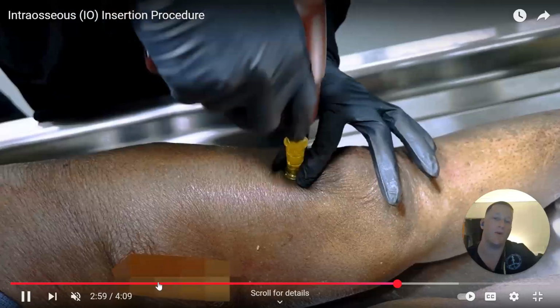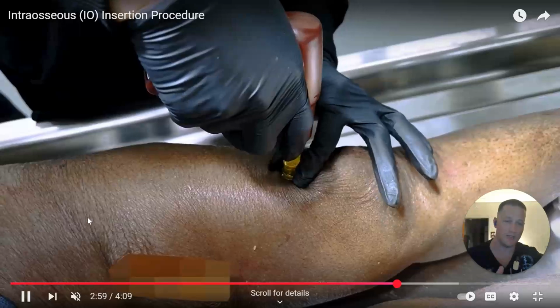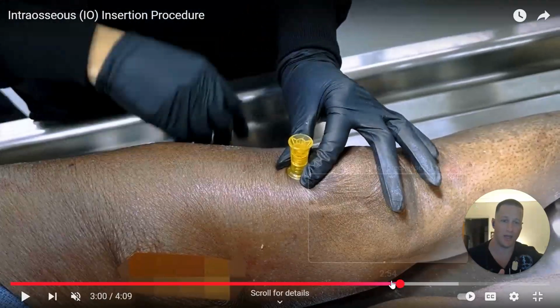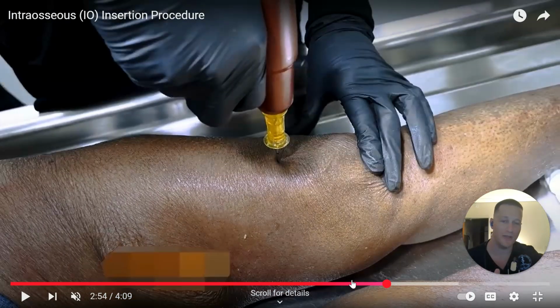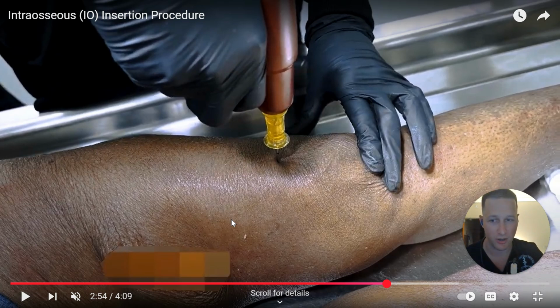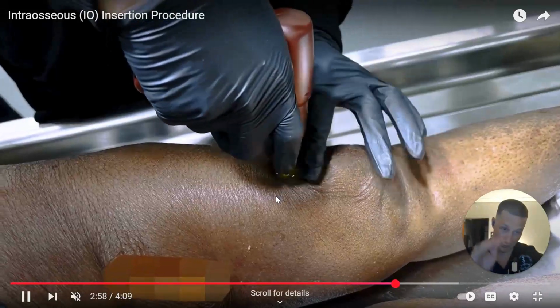And then what I tell people to do is I want them to lean into the IO. When they're going to pull the trigger, it's not like a firearm where it just cracks off the round when a certain threshold is made. It takes a slight bit of time for the gun to reach its maximum speed. So I gun, and then I lean gently onto the bone, and then as soon as it's through the cortex, I will let off the trigger. And then so he kind of kept going a little bit.